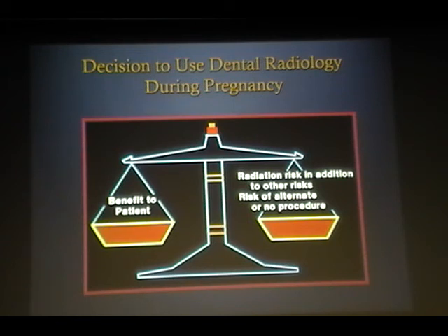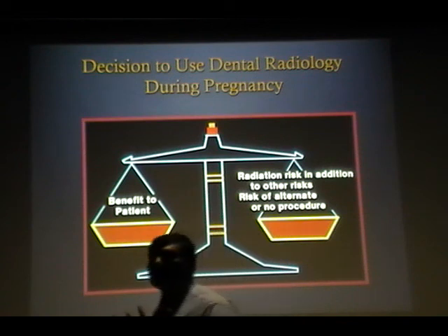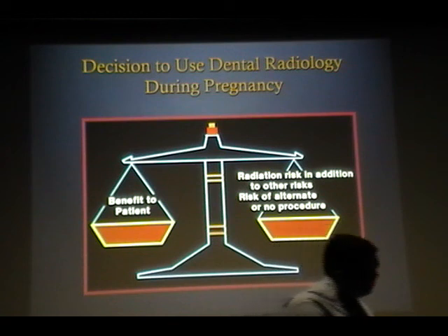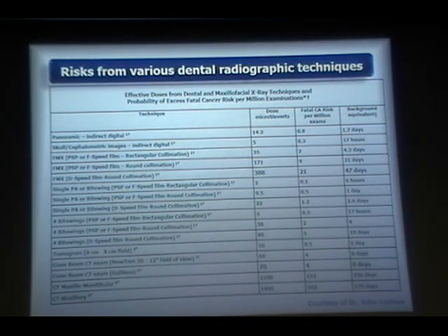Before you obtain a radiograph, always assess what the risks are, and then assess whether it is beneficial. Should I take a PA? Should I take a bitewing? Should I take a CBCT scan? Should I take a CT scan? Do you need more information? So you always have to weigh the benefit against the risk, and decide what is beneficial to the patient. This is a very, very, very important slide for your information and knowledge.